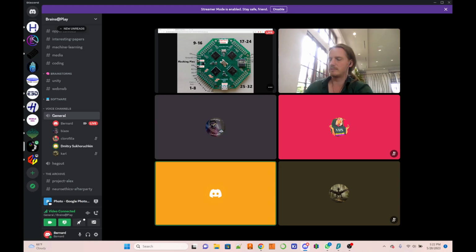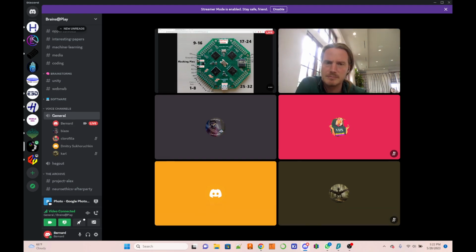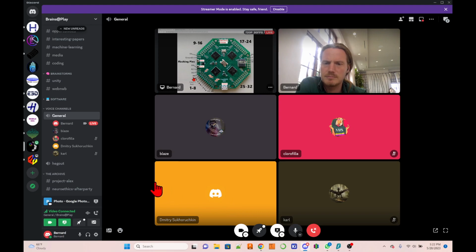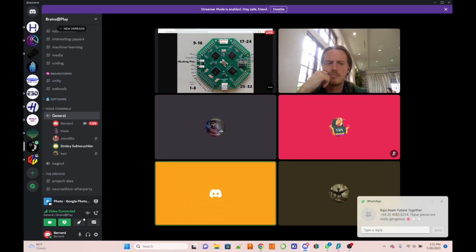Yes, this power isolator is also doing some filtering. So maybe it can make some filtering. Well, I connected it right here at the USB cable. But if you connect it to 5 volts where the debugger is, it's not okay, because all the noise will be inside the board.